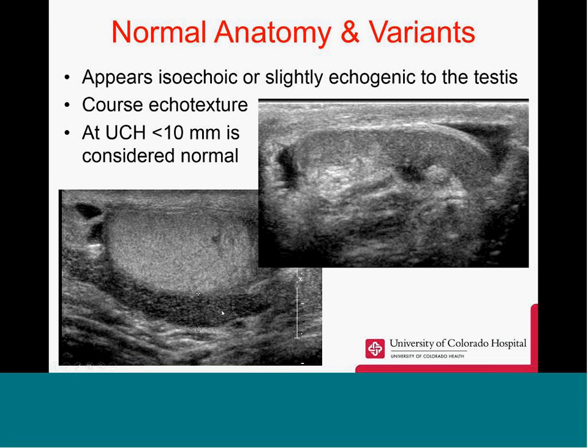Here you can see the body of the epididymis lying posterior to the testicle. In this image here, we see a little bit of the head, body, and tail of the epididymis. Testicle is out of plane.